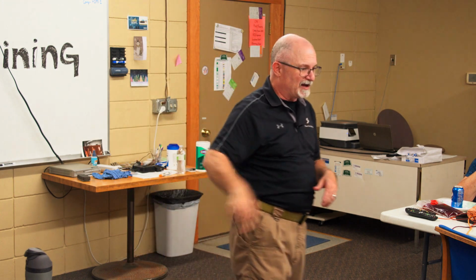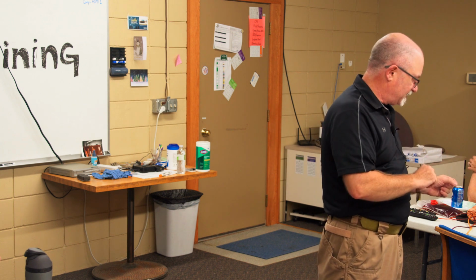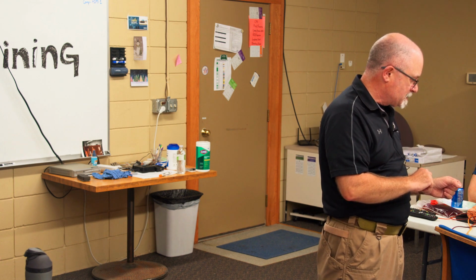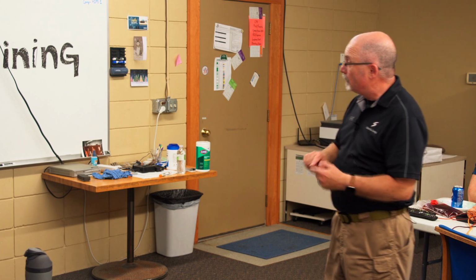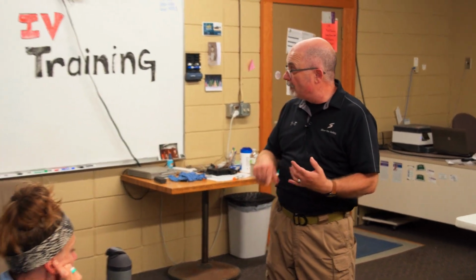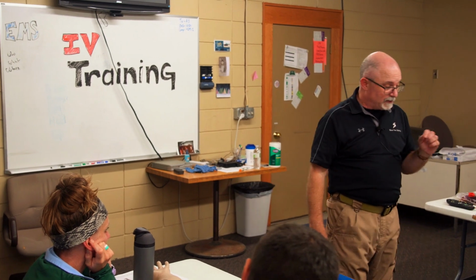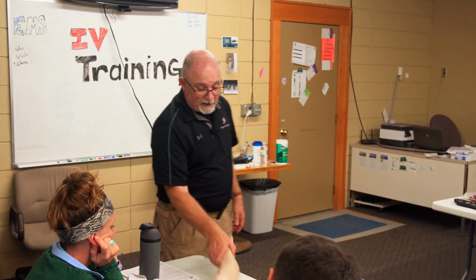Do you guys have a monitor that also does your BPs? Ours are defaulted to 10, so we cover both bases on our automatics, but I'll throw an extra one in there from time to time. Okay, I think that's all the pieces. What else do I have? I think we covered all the pieces: who can do it, what we're going to do, when we can do it, and where, whichever environment. We already talked about that. So good. All right, now we can start playing a little bit.